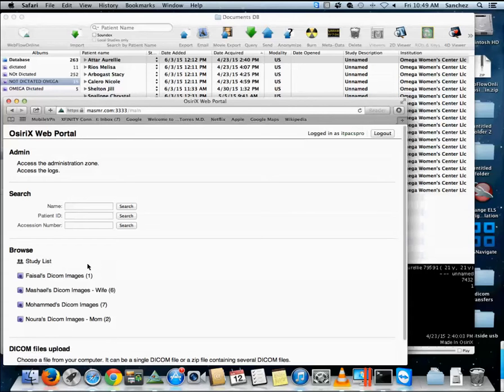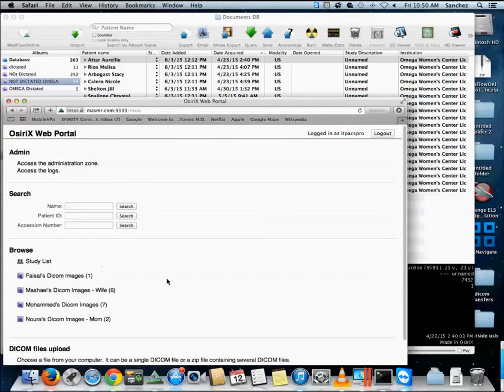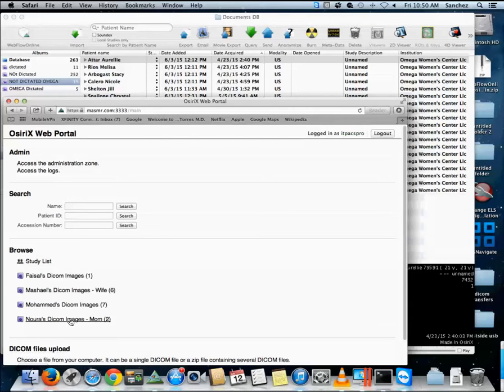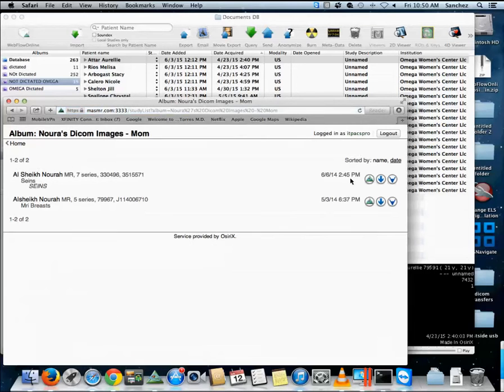And then every 60 seconds it will continue to check those smart albums to see if there is any new files. It will auto download to his workstation, and then when he begins to read he will keep this screen up. And he'll have the ability to mark a study read, and then as he marks it read obviously it will disappear from this smart album because the dictated studies would not be in this query.